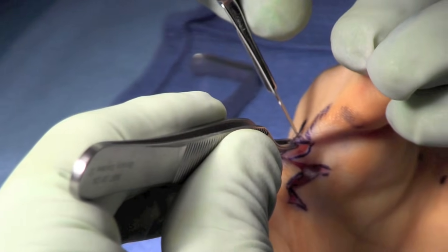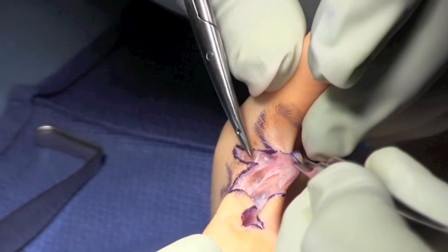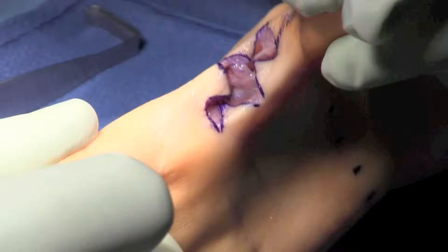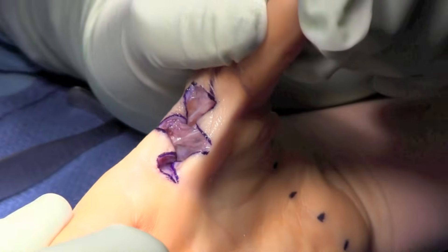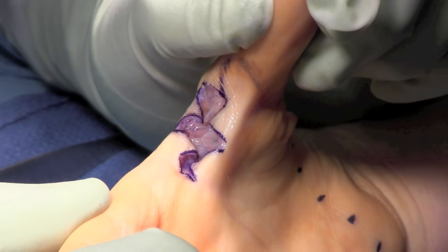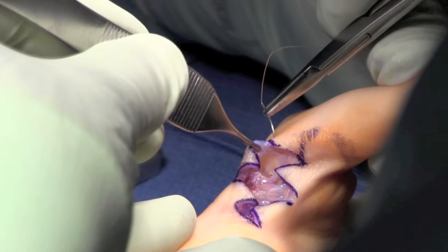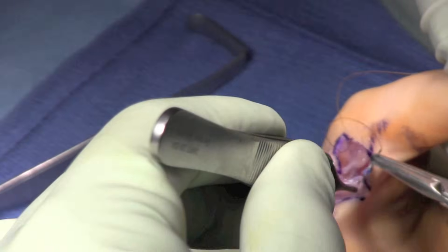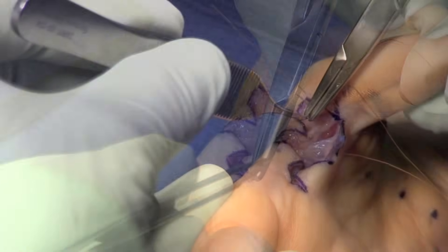Careful dissection is performed, and as you can see, the flaps are very carefully handled. Blunt dissection was performed to ensure that all flaps were released, and then by abducting the thumb, the flaps should fall into their appropriate places if the incision is planned appropriately with equal size limbs.